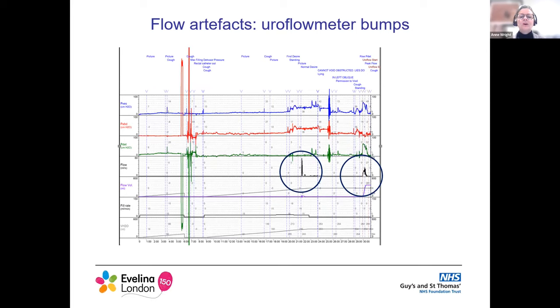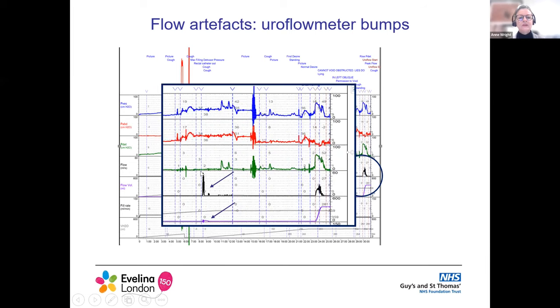Uroflow meters are commonly bumped. Here we have a nice smooth uroflow line together with a rise in P-DET and rise in urine volume flow — that's a true void. Over here, we don't have the corresponding features of a rise in P-DET and no change in flow volume, so this is in fact an artifact.